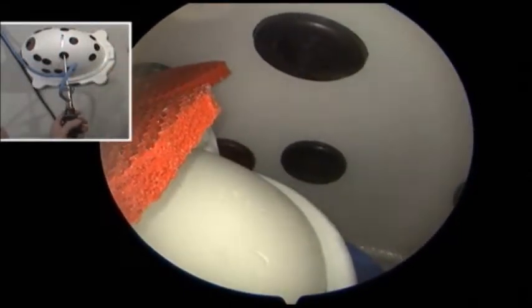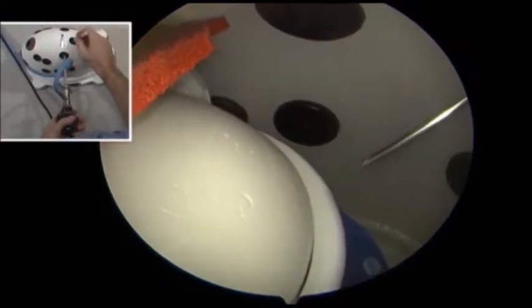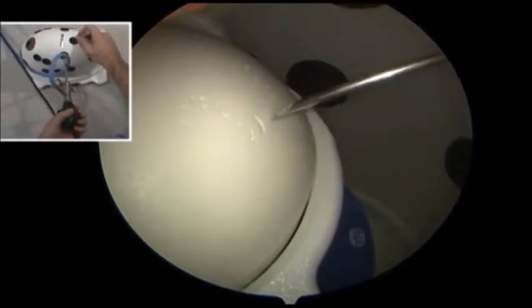I'm going to take my spinal needle and try to figure out where I would like to make my accessory portal. So using our lateral portal, you can see that this probably will come in at too low of an angle.